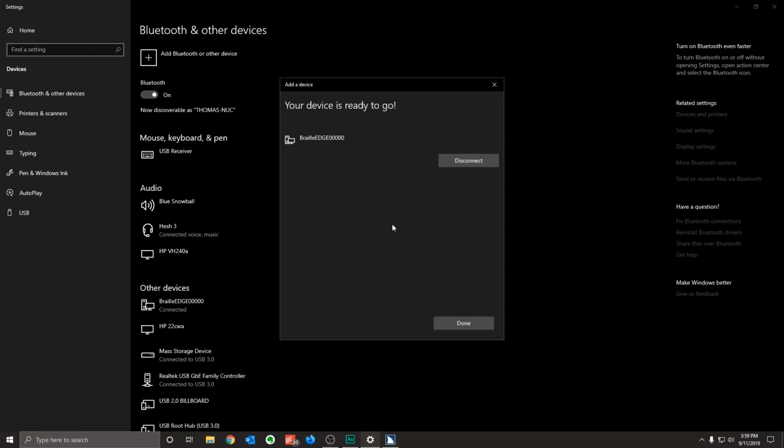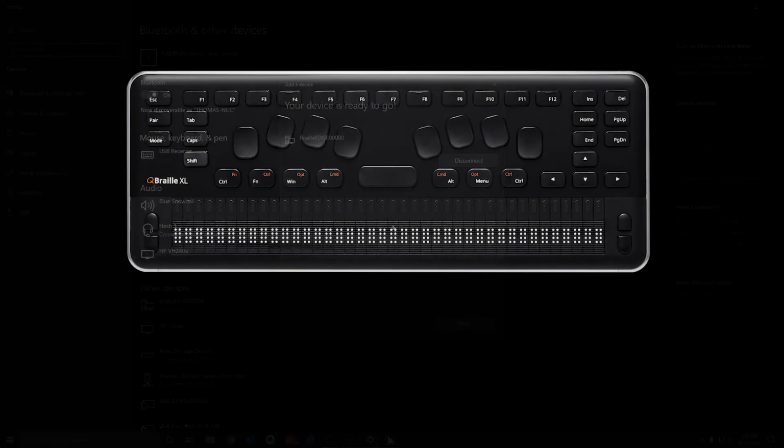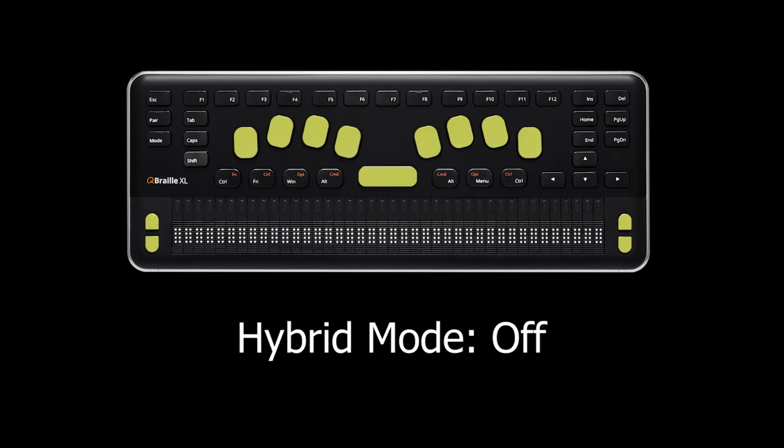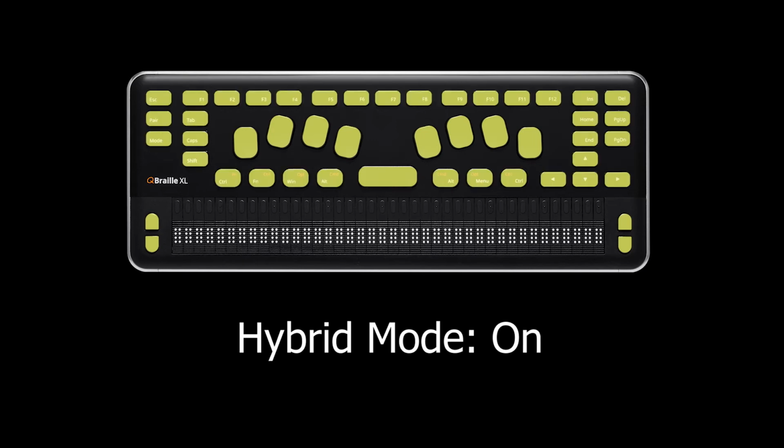Before I move on, I should probably explain what hybrid mode is. So the QBraille XL has two separate modes, hybrid mode on and hybrid mode off. When hybrid mode is off, the QBraille acts the same as any other Braille display. You will use the Perkins keyboard for navigation, commands, typing, and other things. When hybrid mode is turned on, the QBraille will act as a QWERTY keyboard. This means that navigation will be handled with the arrow keys and Tab, and you can use the common keyboard commands directly from the QBraille.